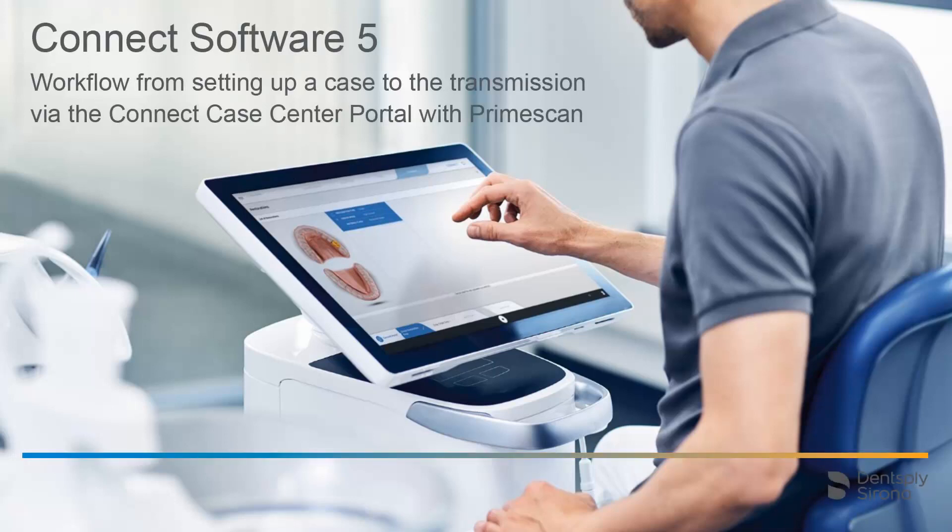Welcome to this video tutorial on the topic of the Connect Software 5. In this video, we will demonstrate the workflow from setting up a case to the transmission via the Connect Case Center portal with PrimeScan.